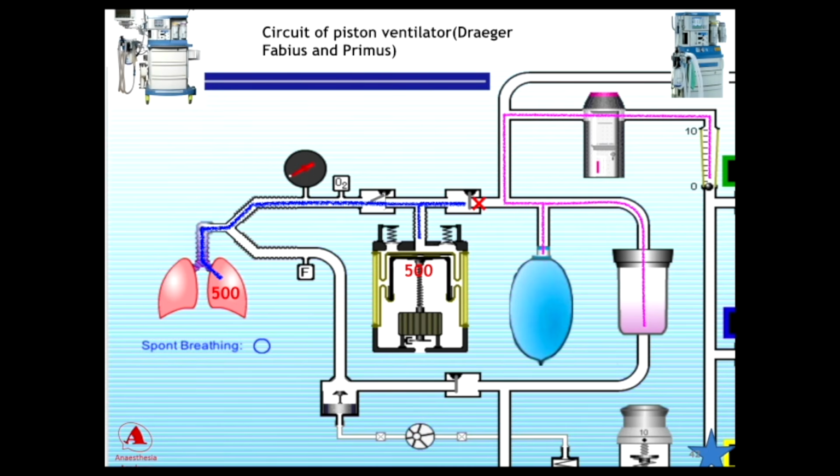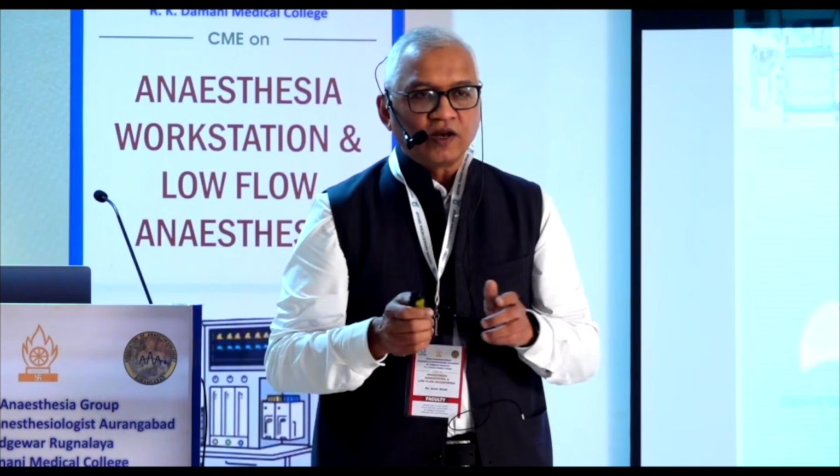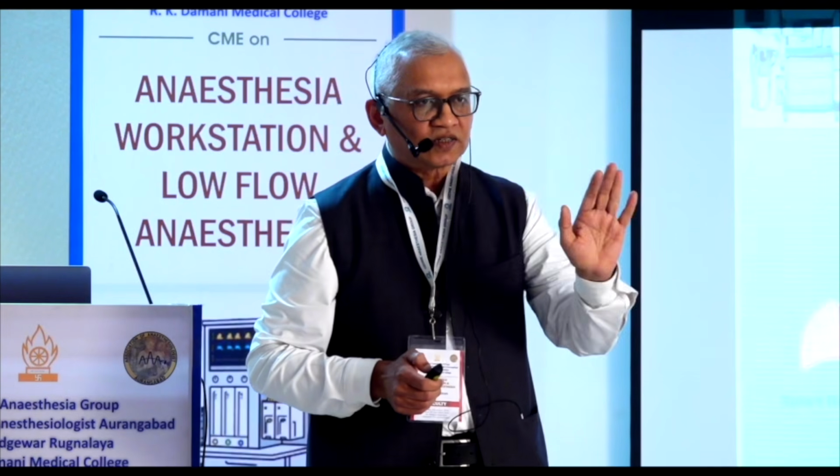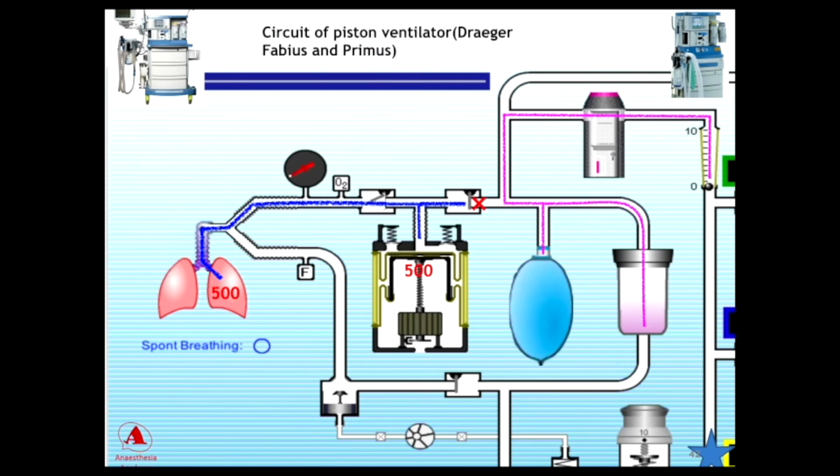So what will the patient get? Only what is delivered by the piston, because fresh gas flow is not mixing here in inspiration. Where will the fresh gas flow go? It will go to the bag. Have you ever observed a different behavior of the reservoir bag in a Draeger machine? It will inflate in inspiration, whereas you would expect it to get squeezed. Every time the ventilator gives inspiration, the bag will expand. That is opposite to our conventional thinking. The reason is this decoupled valve.